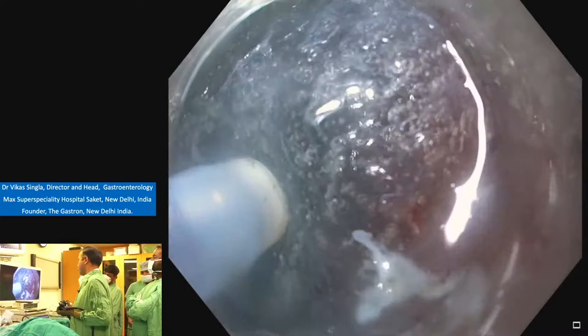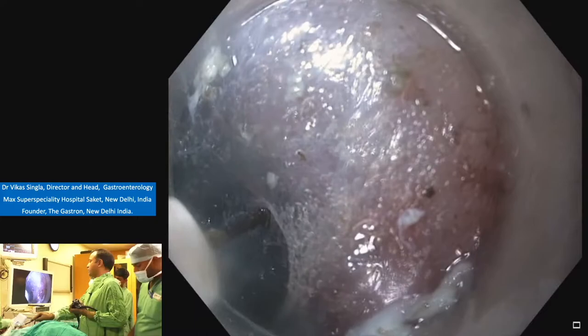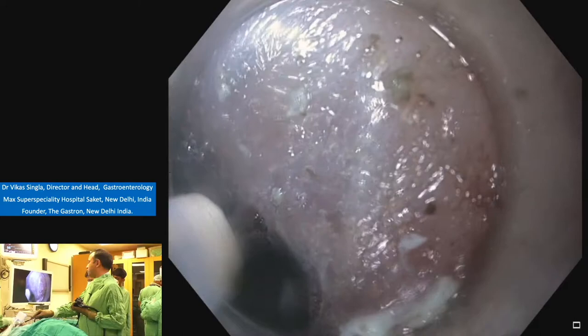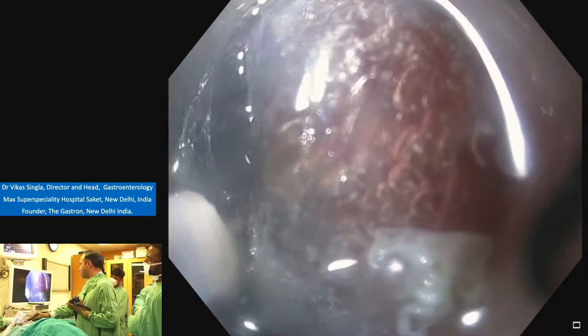Inject more fluid. On the right side is the muscle layer, and on the left side is the mucosa now. So our knife should be directed towards the muscle layer. So inject. We are keeping the line of dissection vertical and using the up and down knob. It's very essential to dissect on the sides also to get more width of the tunnel.